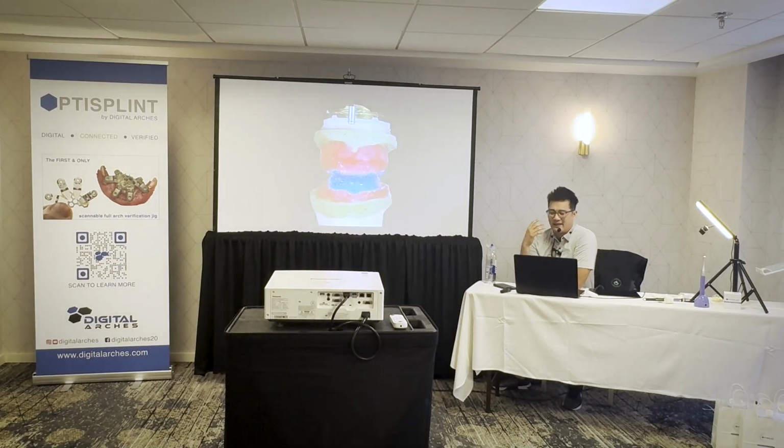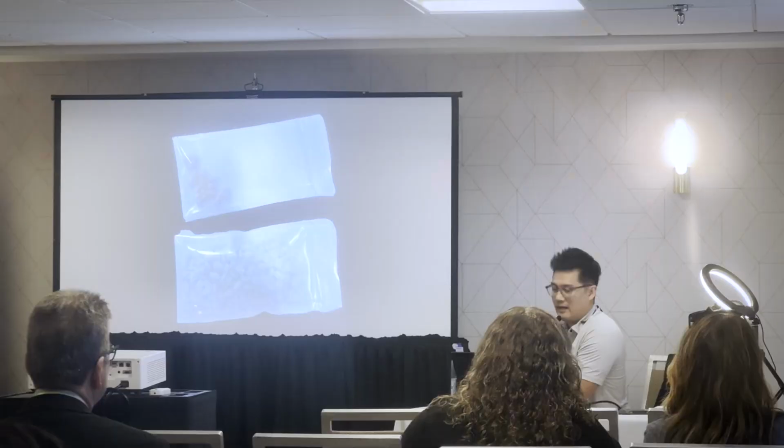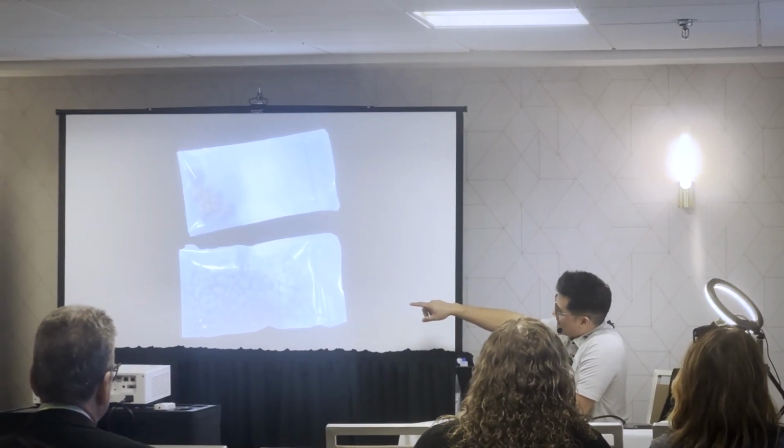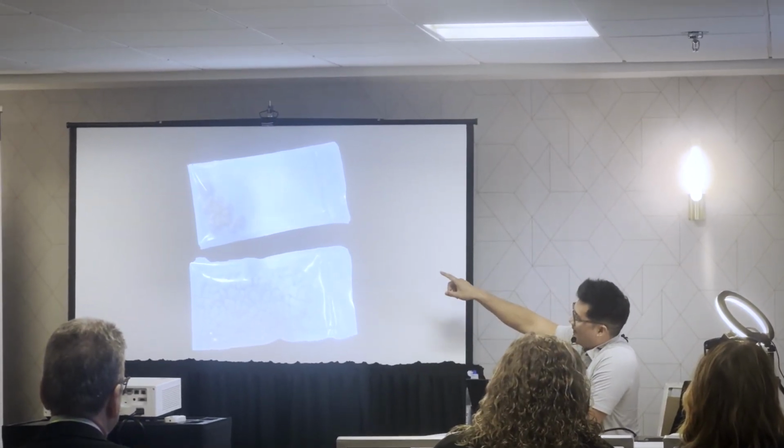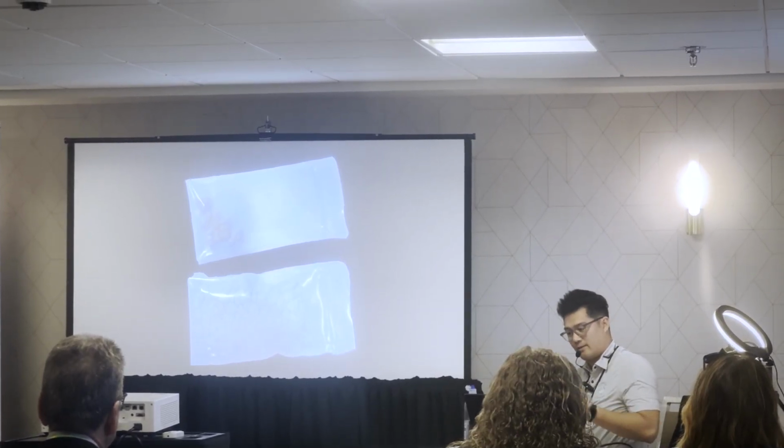And so the question was, okay, well, how do I do this for my digital conversions? And the segmentation marker thing made sense, but I wanted to keep my OPTISPLINT workflow. So I took my OPTISPLINT multi-unit healing cap, and then I scanned it, and then I used a Straumann screw. And I printed these out of a radiopaque resin, and I also milled some out of zirconia, because I wanted to figure out which one was going to scan easier and look more radiopaque.